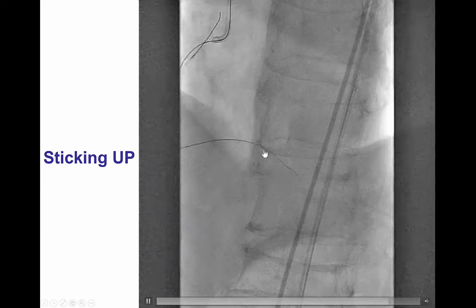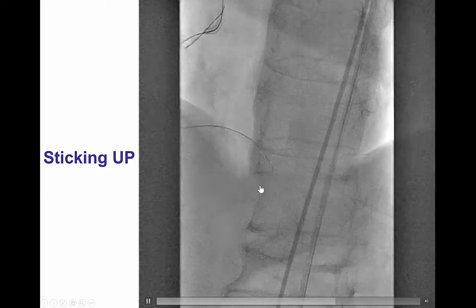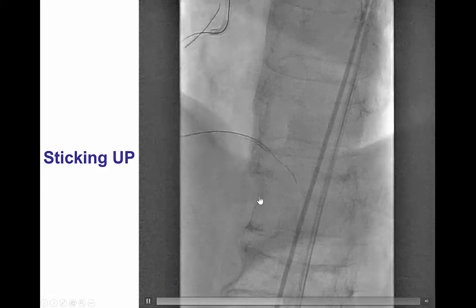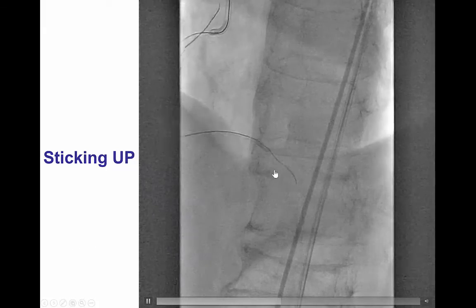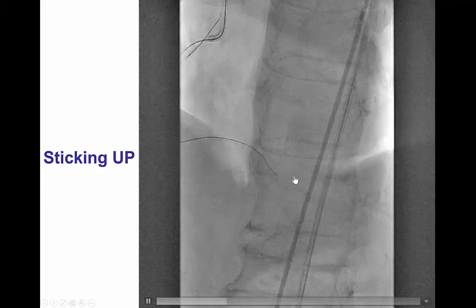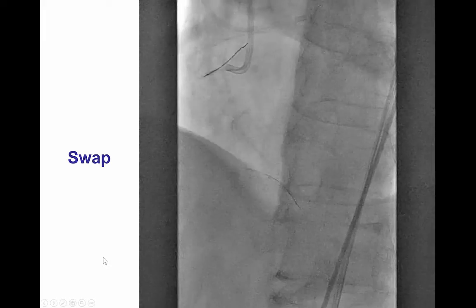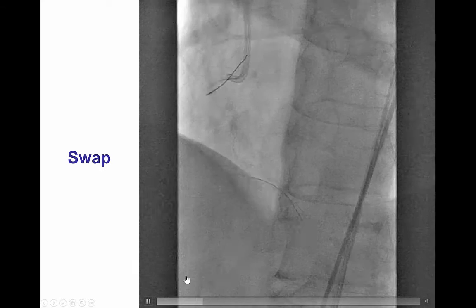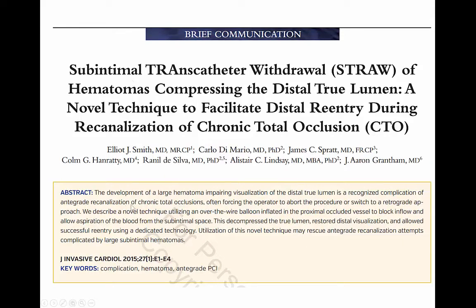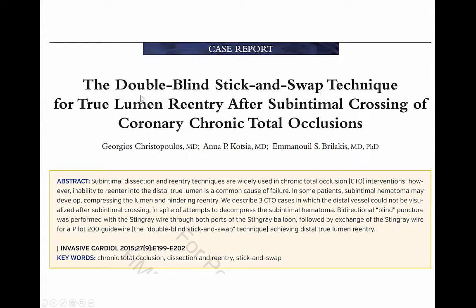We were finally able to advance and deliver a Stingray balloon into the distal part of the occlusion, right next to the posterior descending artery, and then performed the double blind stick-and-swap technique. Here is the Stingray balloon — we advanced the Stingray wire in both directions: proximal to the proximal marker, then the wire is withdrawn and advanced between the two markers going in the inferior course. After doing that, we changed to a Pilot 200 guide wire advanced through one of those areas. The straw technique applies suction to minimize hematoma compressing the distal true lumen, while the double blind stick-and-swap technique involves sticking through both sides of the inflated Stingray balloon and advancing a polymer-jacketed guide wire to select the exit point connecting with the vessel.